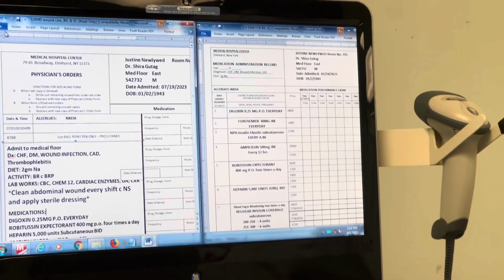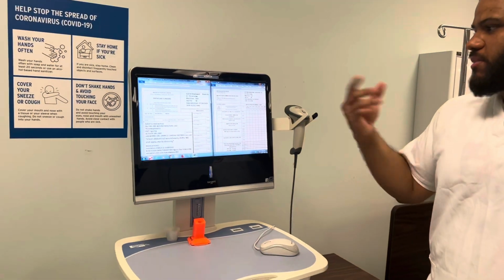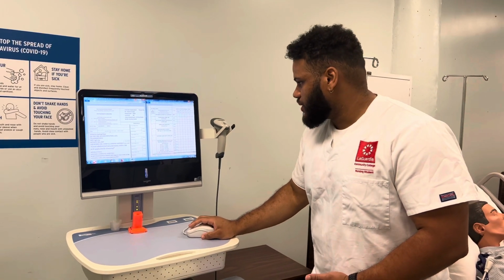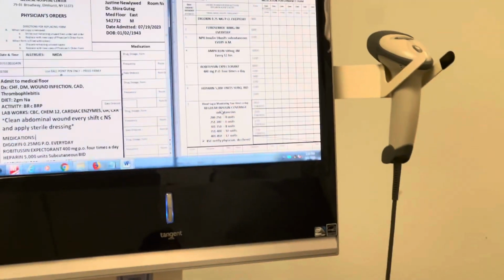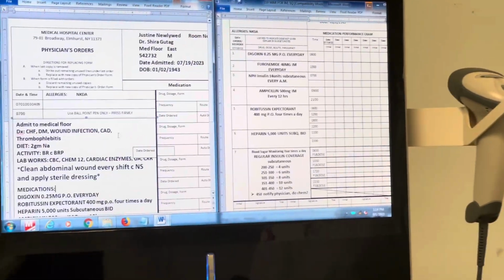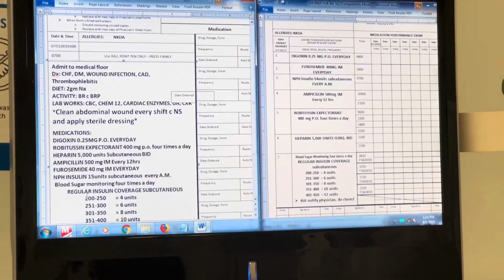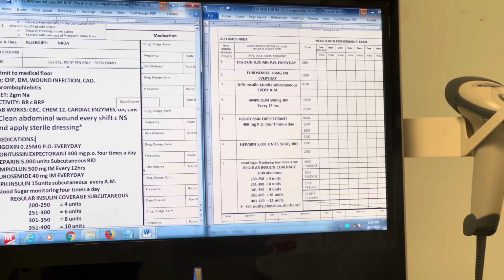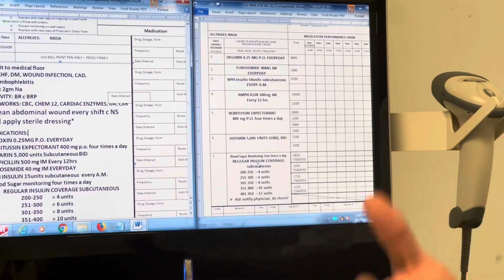And then from here, we're going to verify the medication. So we're going to give a SubQ regular insulin. So we're going to look down here at the medication administration, regular insulin. She gets it 4 times a day, and I verify it by looking at the doctor's orders. Blood sugar 4 times a day. First dosage is at 8:30. And the dosages is dependent on the sliding scale.